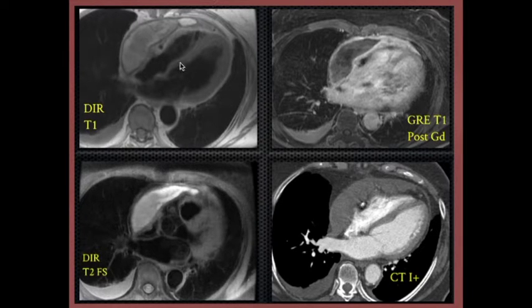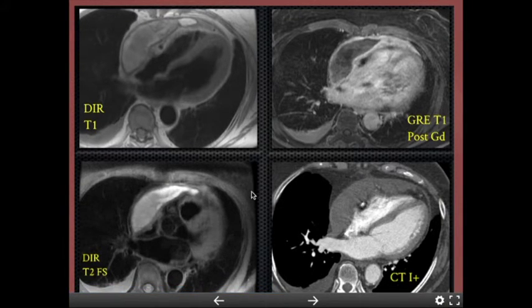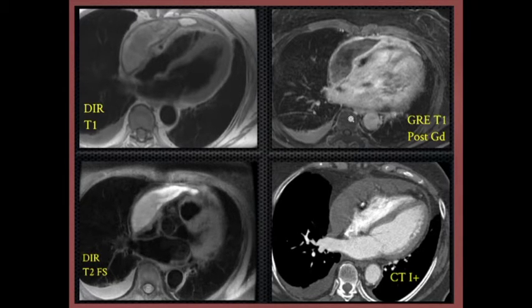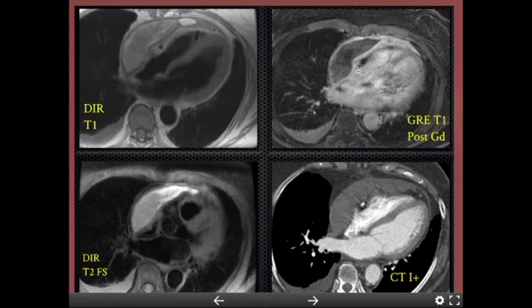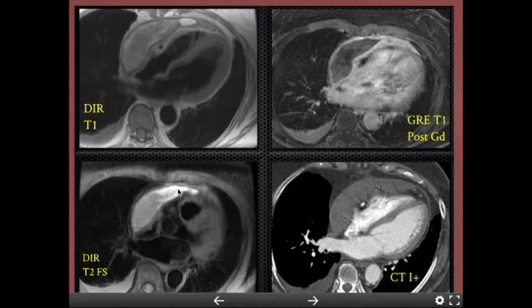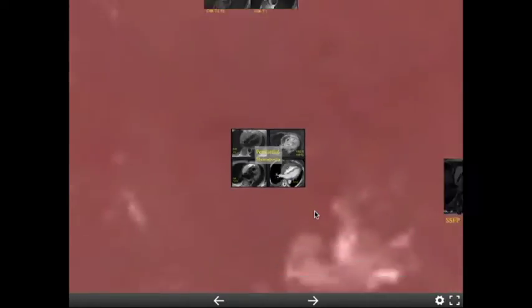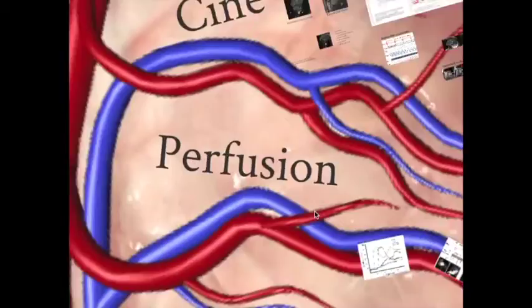Another case: T1 double inversion recovery black blood without fat sat; T2 black blood with fat sat; CT scan with contrast; and gradient echo T1 post-contrast — similar to VIBE used for renal masses or brain tumor enhancement. We have a loculated fluid collection with intermediate to bright signal on T1, bright but heterogeneous on T2, peripheral enhancement without central enhancement, and approximately 50 Hounsfield units on CT. This was a pericardial hematoma. That's how we use tissue characterization.